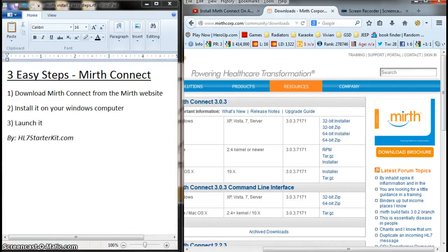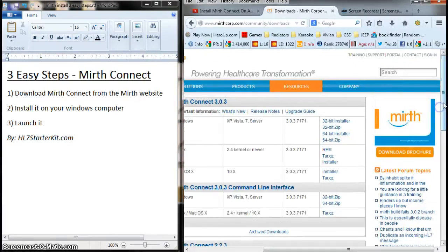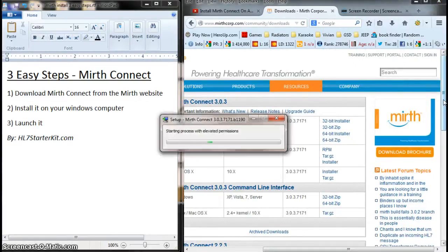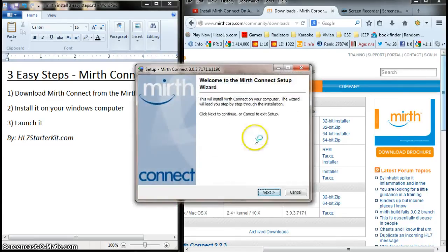My computer is a little slow here, but it'll catch up. Probably because I'm recording as I install this. And here we go. I'm going to click Yes. Trust Mirth Connect.